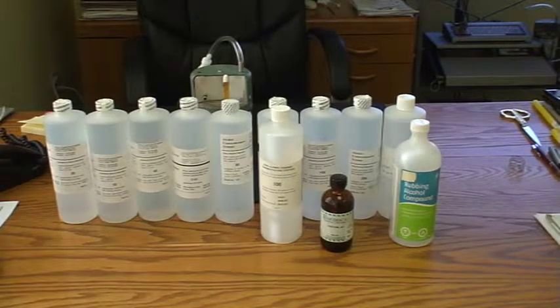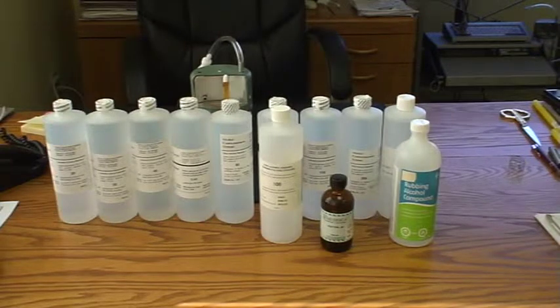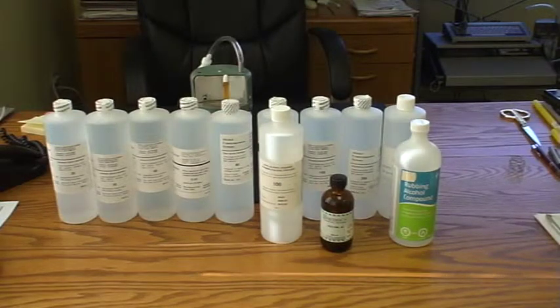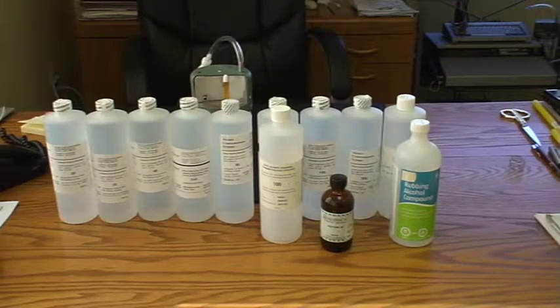The advantage of using a simulator, of course, is that you've got a controlled environment in which you control the temperature and you make sure that there is no leakage of air and no gaps in the seal, so that every bit of air that is pumped out of the Intoxilyzer and through the simulator comes back through when it's recirculated back into the Intoxilyzer. And it's only if the whole system is sealed up that you're able to make sure that you have an accurate alcohol standard being fed into the Intoxilyzer.